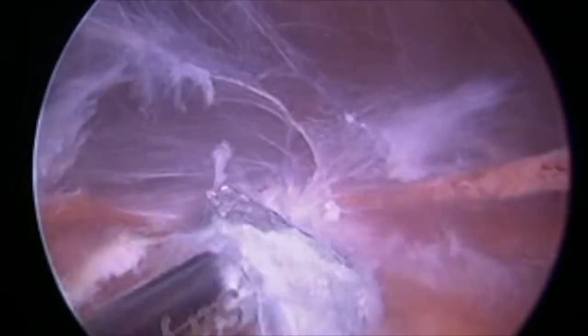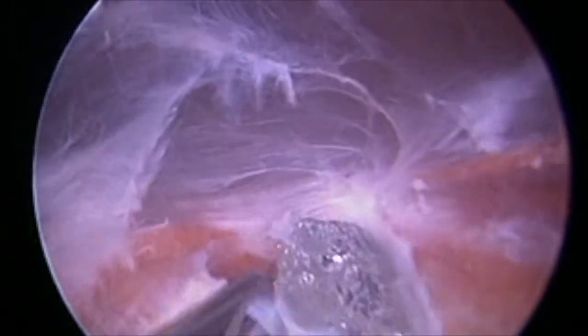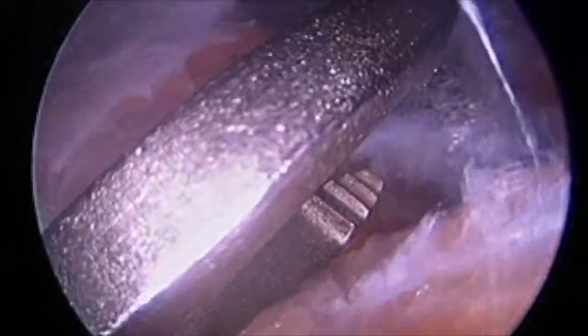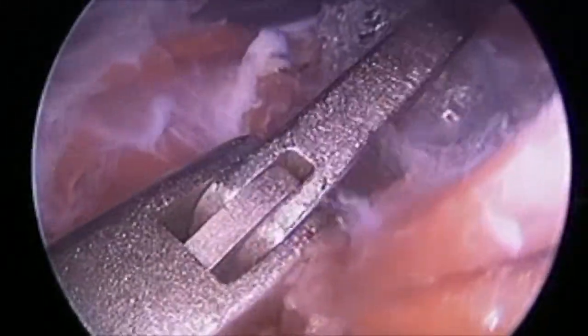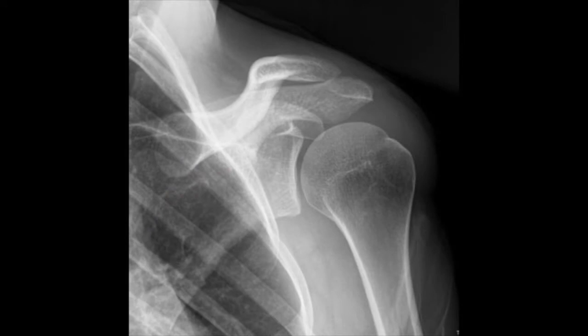Here you can see locating the bullet fragment and carefully teasing that out of the chest wall with very little trauma or disruption to the muscle fibers there. By removing this bullet fragment we will of course solve the pain and popping in the shoulder blade. Here again you see the before and after x-rays with the bullet removed.